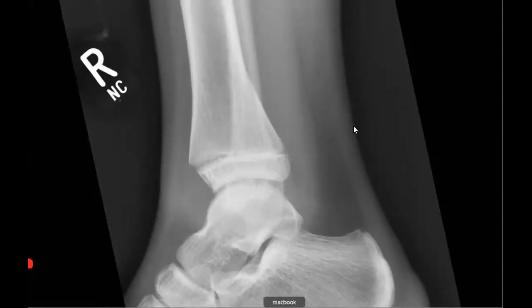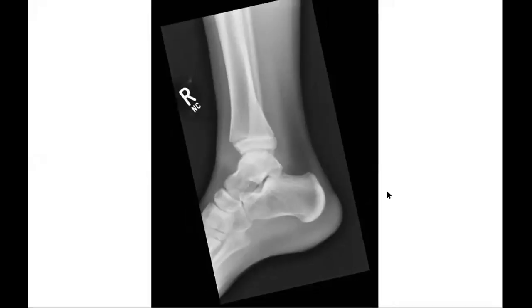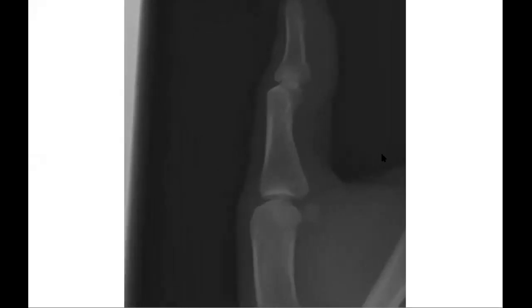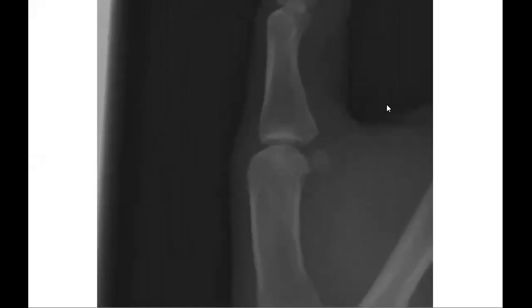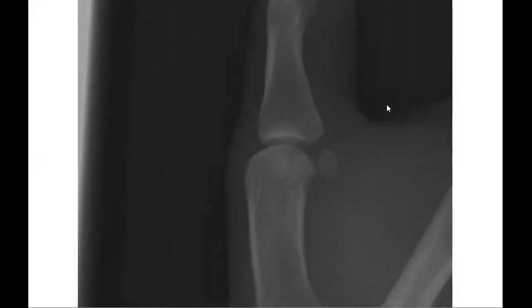Yes, is here. I agree with you, Ivan. So there is a Salter-Harris fracture. Yeah, I will draw for you.